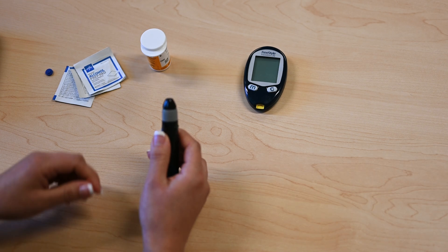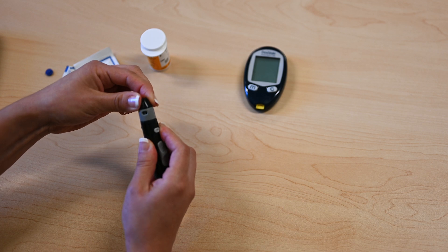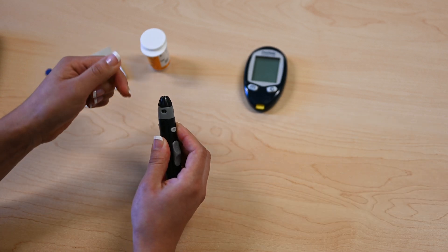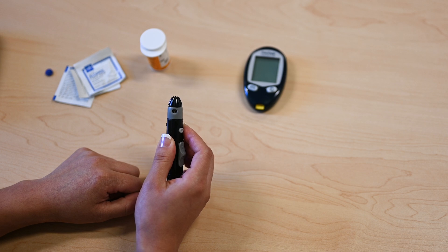Use the dial to set the depth of the needle to 2, or somewhere in the middle of your lancing device's setting. If you're not getting blood consistently from the lancing device, dial up to the next number.